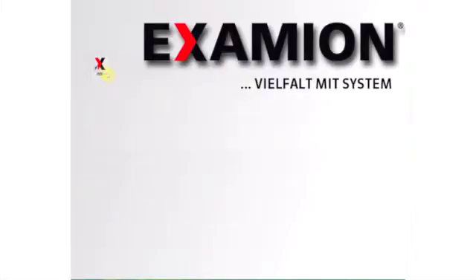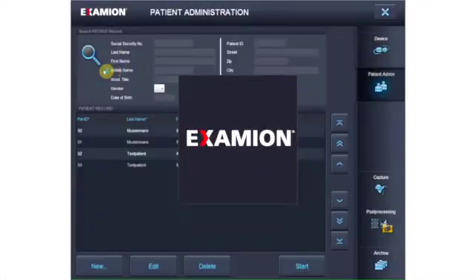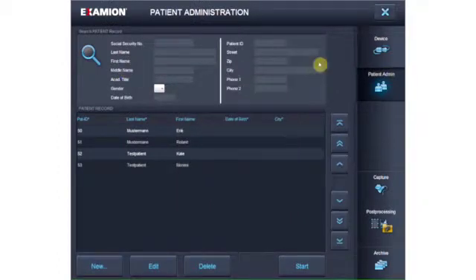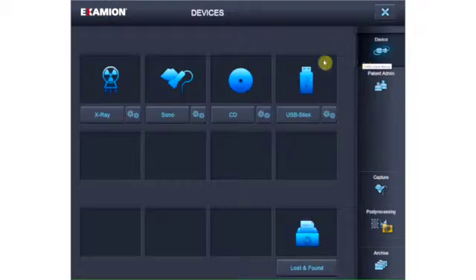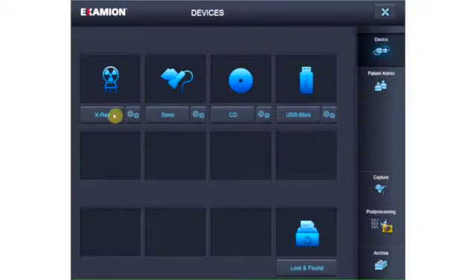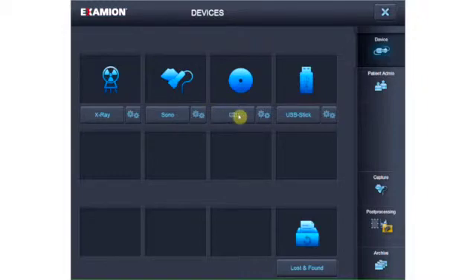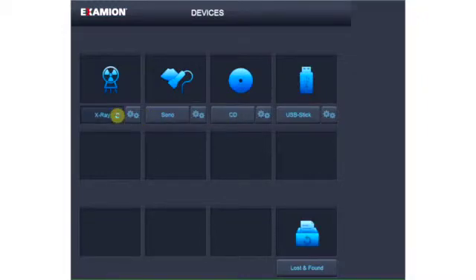Examion AQS software has a variety of modules to work in as needed: the X-ray module, the Sono Video module, the Image Import module, and many others. Changing from one module to another is quick and automatic.